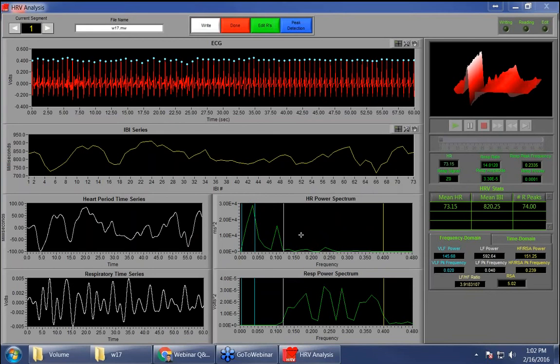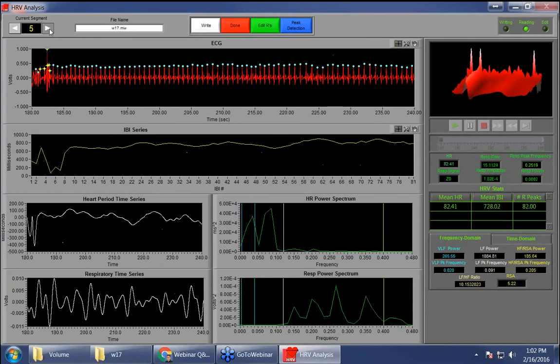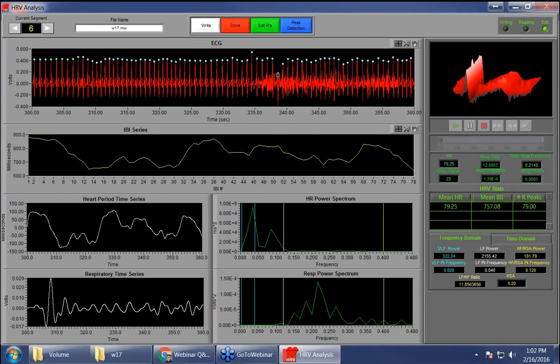Okay, we have one question about how do you know what percentage you've edited? There's a few ways you can go about this. One easy way is basically in how many you're artificially creating. So let's go to the third one. This one right here that we had to, actually I think it's 6. Yeah. This one right here that we had to kind of put there artificially, that would be 1.